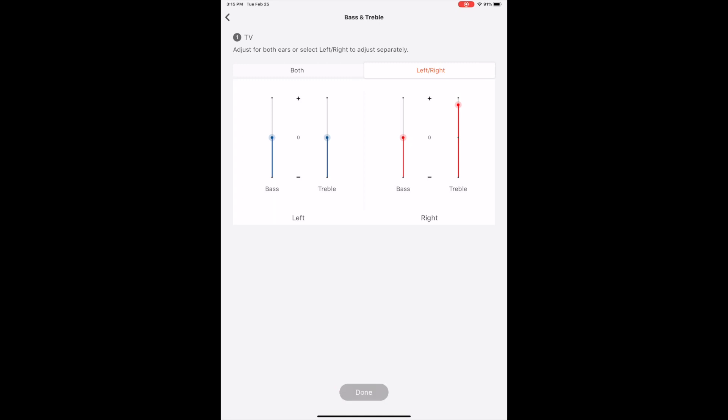For example, I can boost treble all the way, I can bring it to the middle, or I can bring it all the way down. I think that if Ergo was really on top of things with this, they would have at least made quarter settings, if not eight different settings, so you could truly fine-tune based off of your hearing.